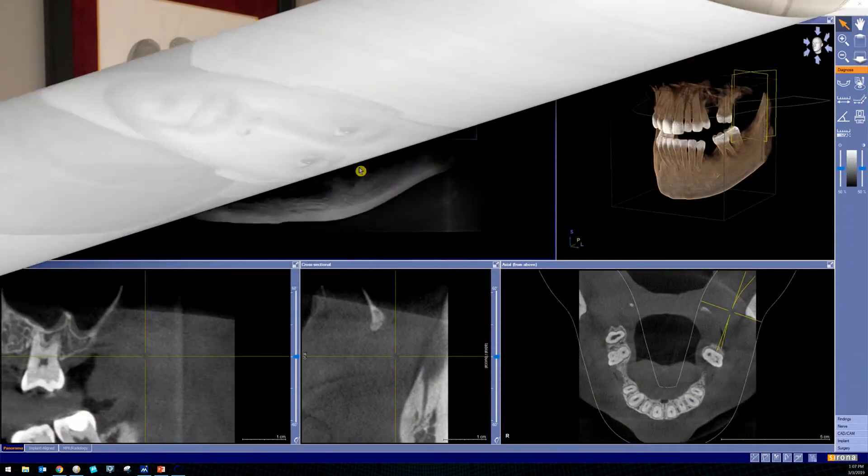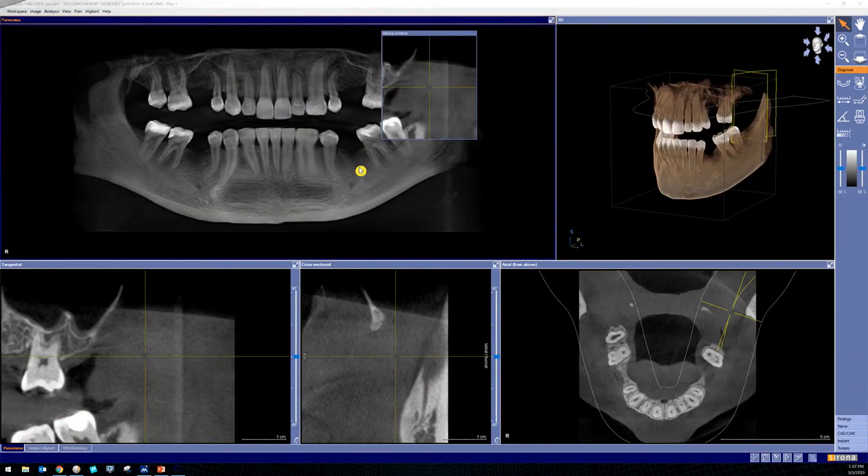Hey everybody, this is Quentin Flores with CVCTmadeeasy.com. In this video, we're going to focus on setting the panoramic curve for your 3D volume in the Galaxis Galileos implant software. Let's get started with showing you how to adjust the panoramic curve.